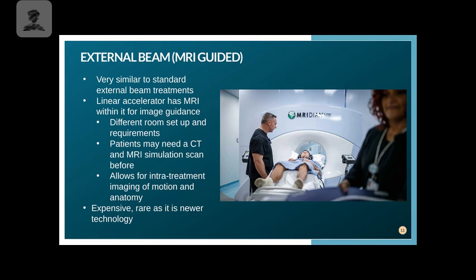And that's what we call intra-treatment imaging. So it's within the imaging; we're already doing the treatment. It's happening. One thing that is kind of a downfall is that with these patients, the way that the linear accelerator works, we have to have a CT done prior to be able to calculate how much dose would be given by the linear accelerator to the different structures.